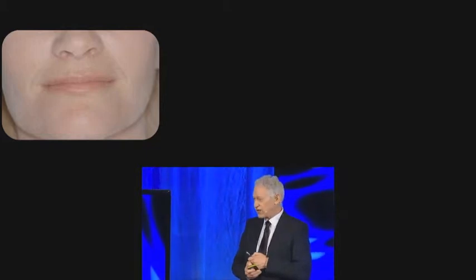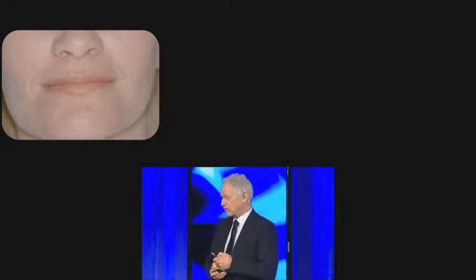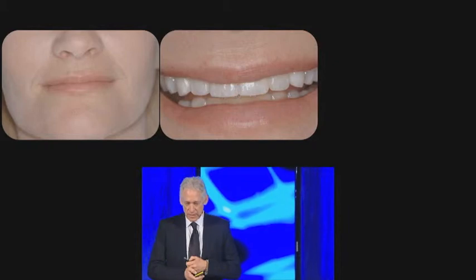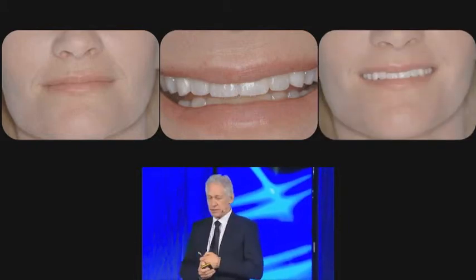The facial changes are immediate. Remember, the distance B, base of the nose to the lip, is there. The eversion of the lip is there. And that's exactly the extraoral appearance that we want.